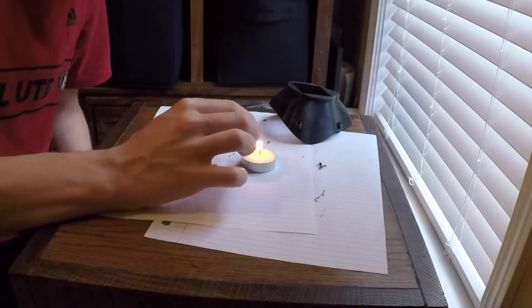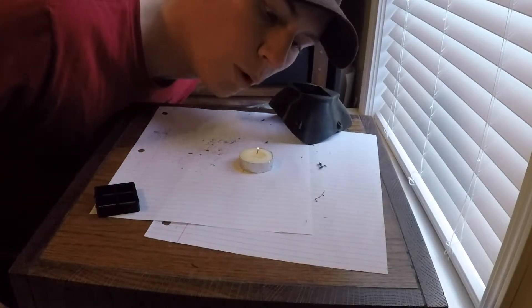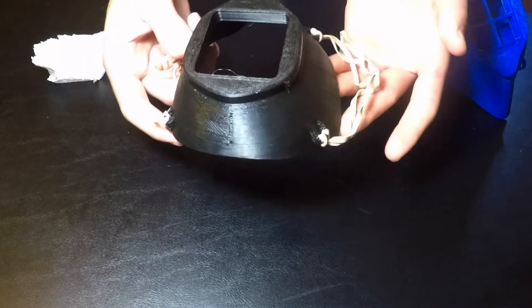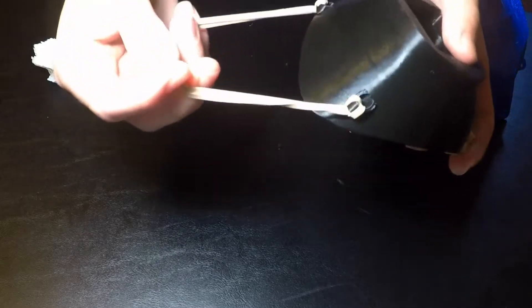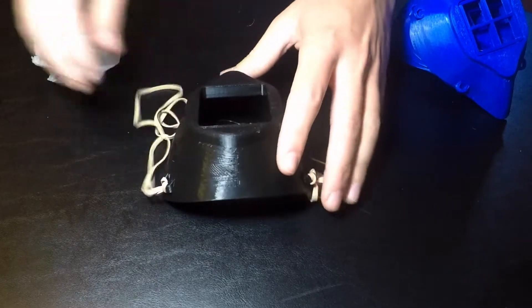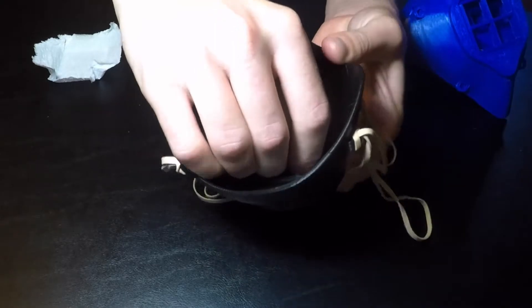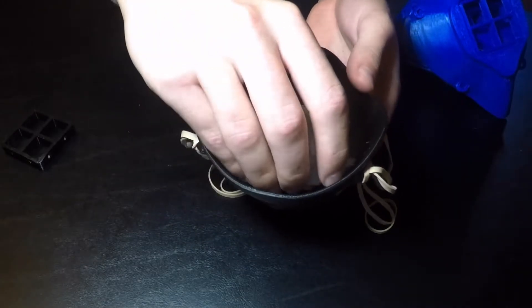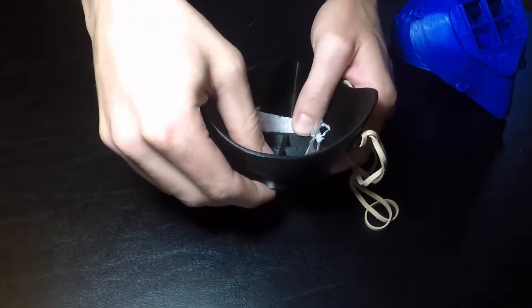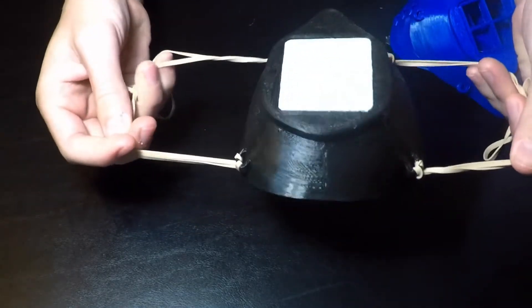Here we have our finished 3D printed mask. I've hooked rubber bands around the little loops to go around your ears. In the middle goes this little grid piece to hold the filter in place — it just goes in right there, just like that. For a filter, I have a piece of paper towel — you can use any piece of fabric, paper towel, or napkin, just anything to filter the air. It goes around the grid and fits in just like that.